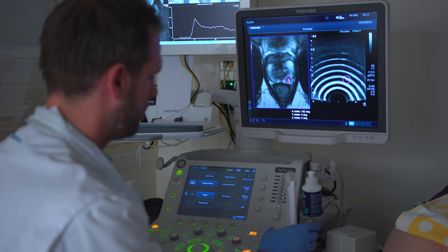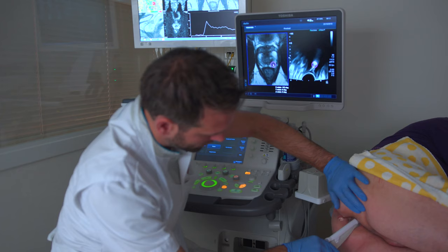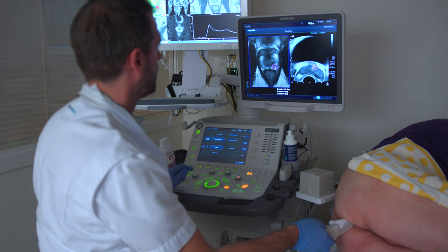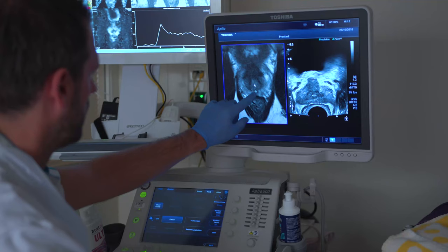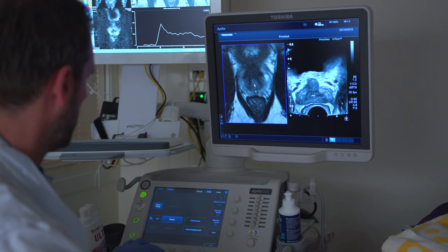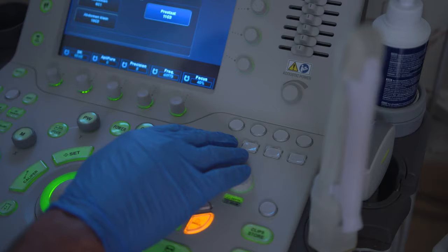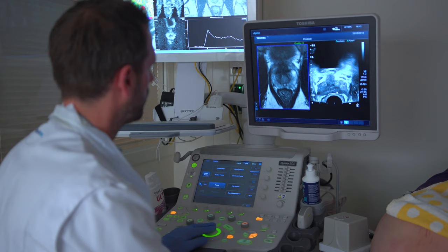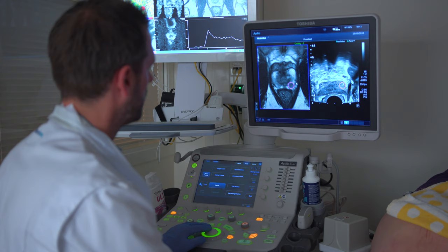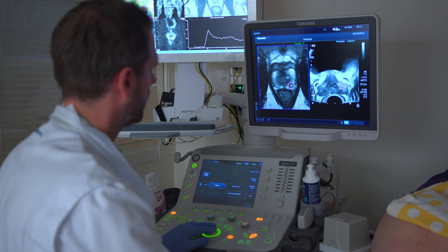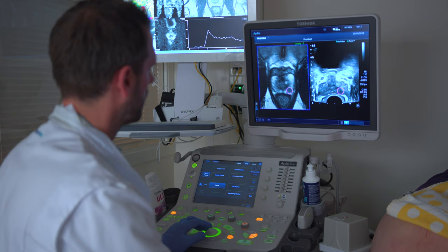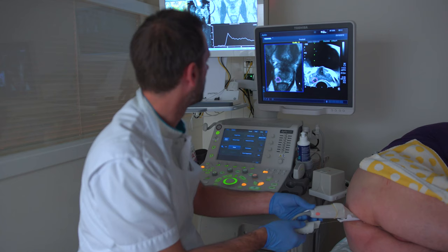The following step is to synchronize the MRI and ultrasound images. For this you have to find the same anatomical landmark on both the MRI and ultrasound. Once you have found this landmark, you can confirm the registration and start the procedure. The MRI and ultrasound are now synchronized. For improving precision, you can repeat this procedure with additional landmarks, preferably as close as possible to the lesion. It is important for the patient to lie as still as possible during the procedure. Once you have optimized the fusion, you can start taking the biopsies — usually no more than two or three targeted biopsies are performed.